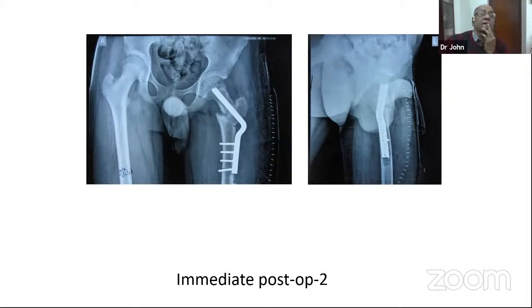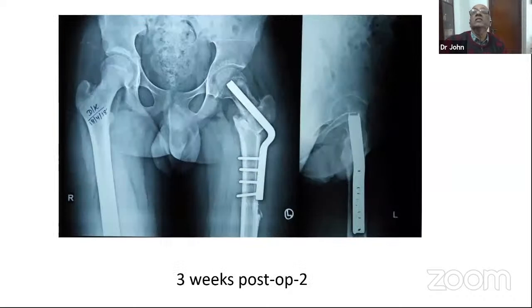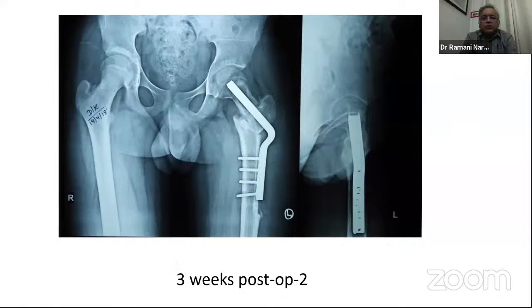But I think, like I said, the newer generation is not easily available in the proper quality as well. So this is an issue with this. So this is him at 3 weeks post-op. Any comments about the length of the plate? He's 14 years old, right?